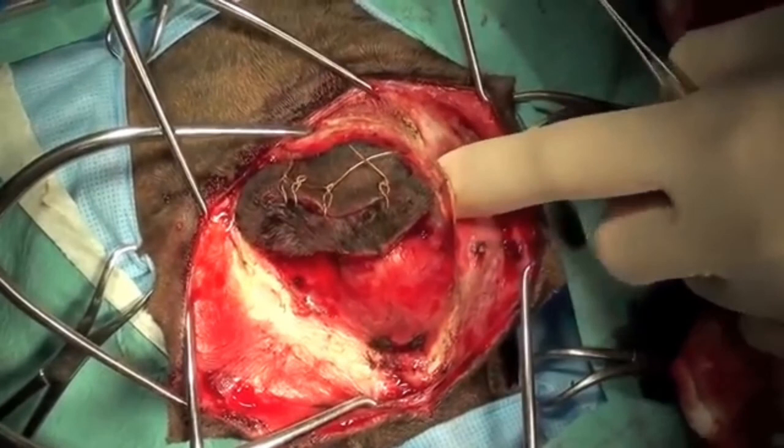Just one touch of the cautery and that's it. Oh, this is a craniotomy, I guess. Yeah, it's a craniotomy. Alright, so you can see it looks like a very invasive procedure, but there's almost no blood bleeding because they're using electrocautery really well.